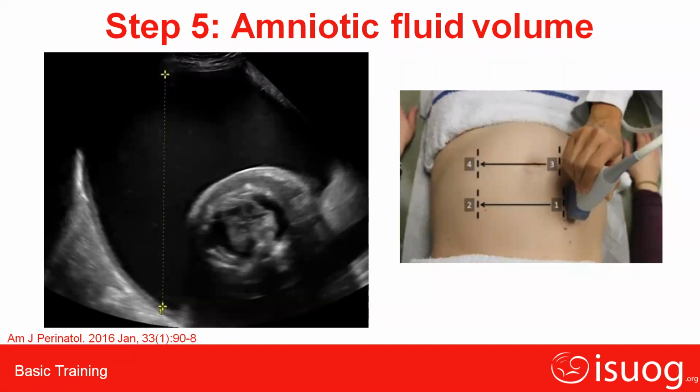Yes. Ashwini Vishwanath is asking which one is more specific, AFI or SDP? I think he's asking about the vertical pool. What is single deepest pocket? Yeah, single deepest pocket.